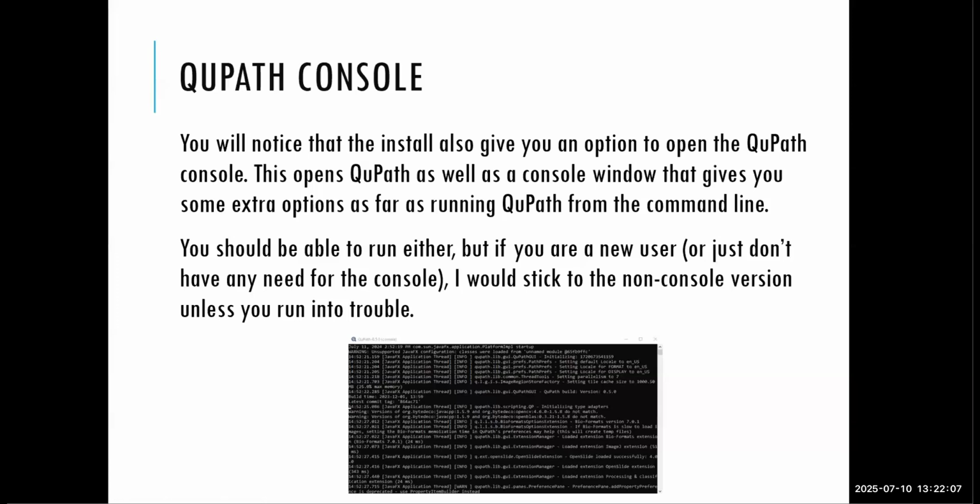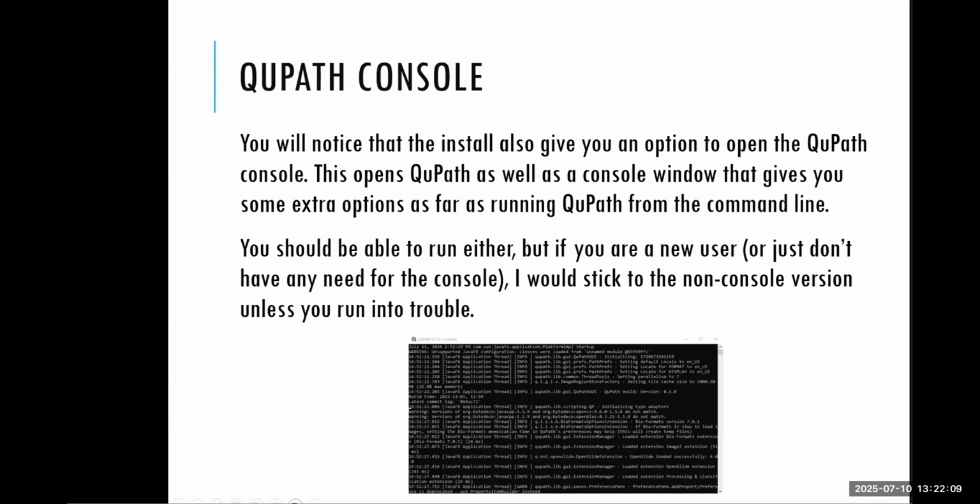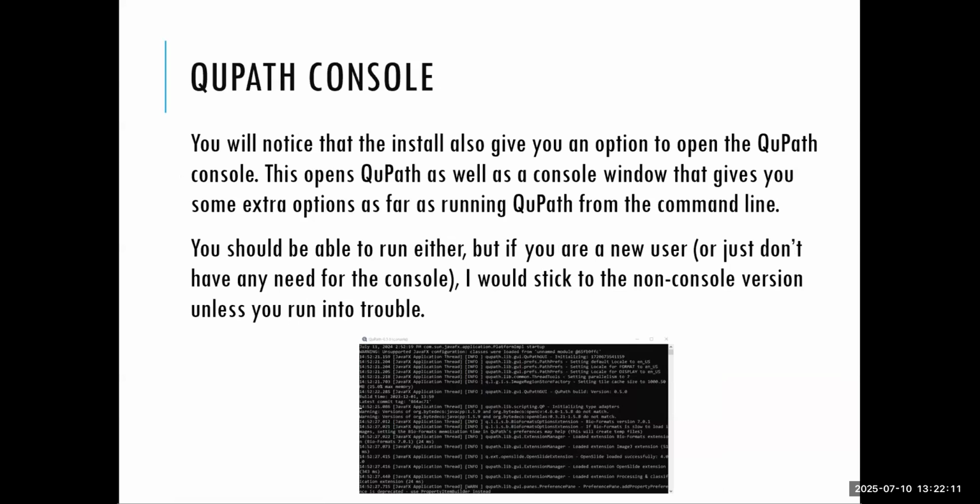So this is QuPath open. Now, you may have noticed when you installed QuPath that you got two icons. One was QuPath and one was QuPath console. The console gives you a command line as well as the software. You can open either one.